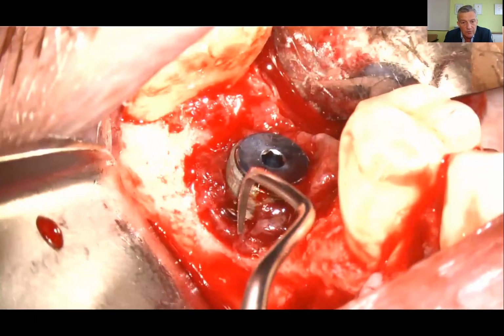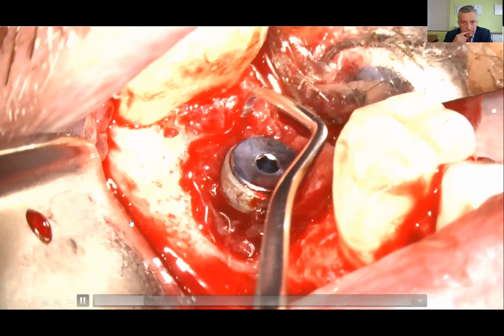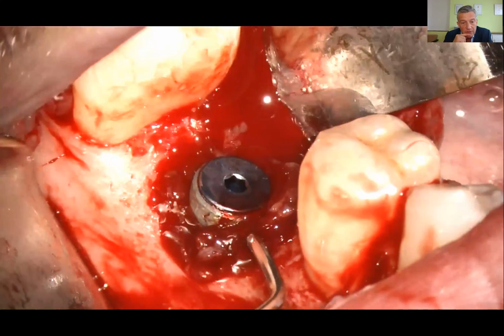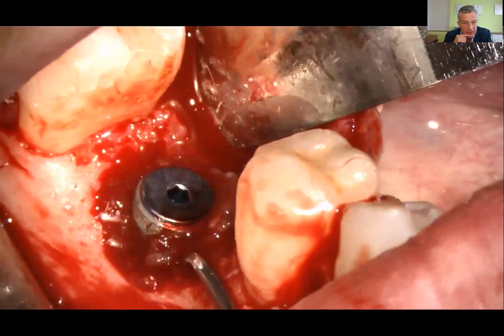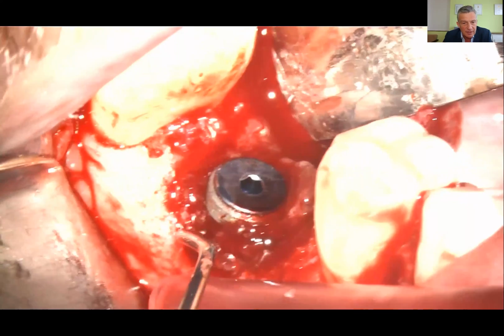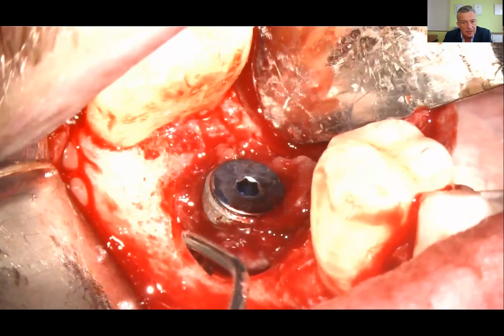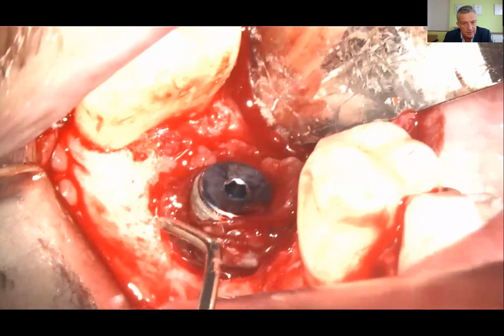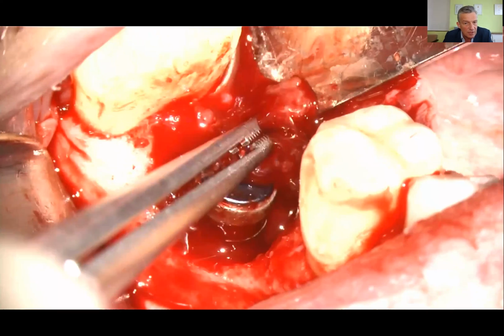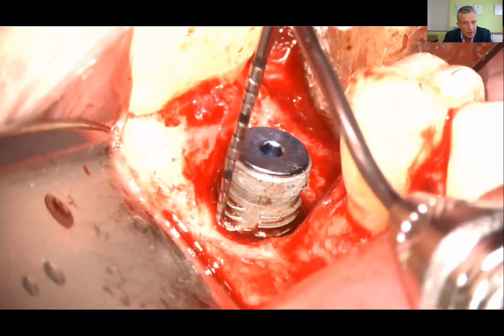First of all, we remove the granulation tissue. It's very easy if you work to the bone. Don't pull on the granulation tissue, otherwise it will tear and it takes more time. Work to the bone, and then it's very, very easy to grab the whole granulation tissue with a forceps and to remove it. And then you can start cleaning the implant, remove the cover screw.